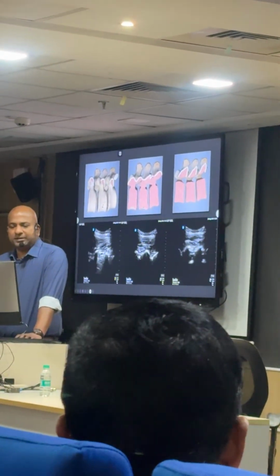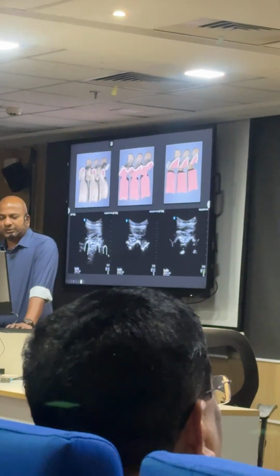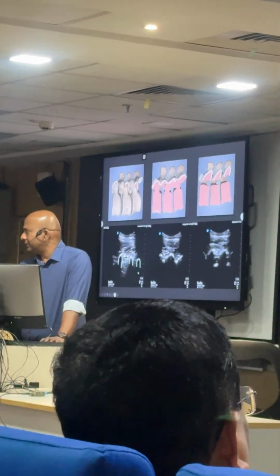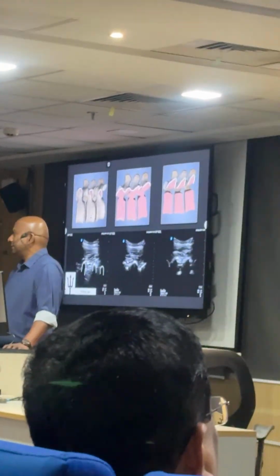When you put a paramedian sagittal oblique view, you can see that these are all the tips of the transverse process, and you can see a dense shadow below. Are you able to appreciate how the image has been created? Since it looks like a trident, they called it a trident sign.